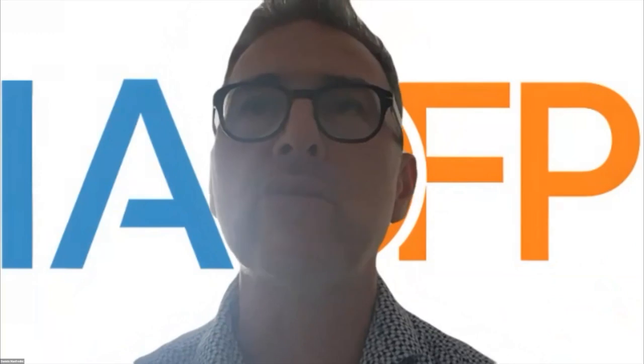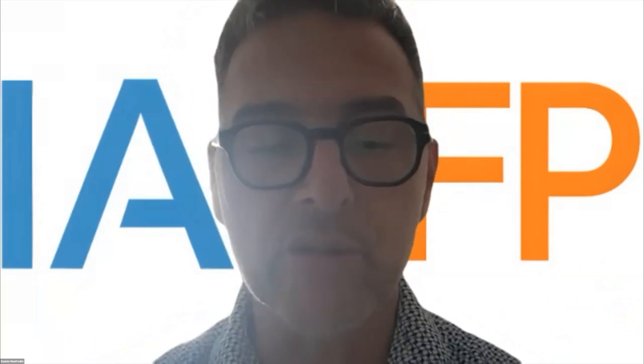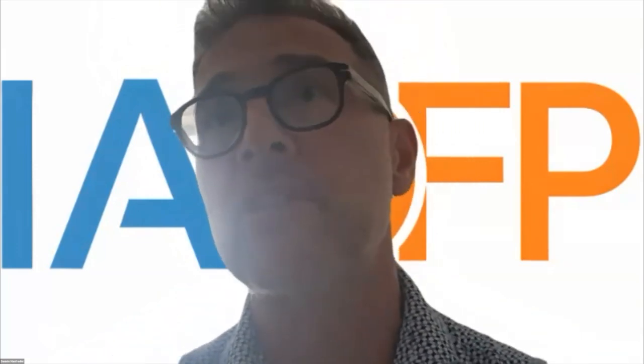So I will invite everybody to read the very nice paper from the 90s from Freibeck in the Medical Imaging Journal concerning the effective prescription of TMJ imaging, or imaging in general. When you have a chance that your imaging prescription changes the treatment outcome, it's the time to prescribe it. That's how I see it.